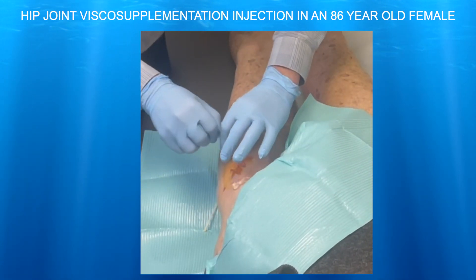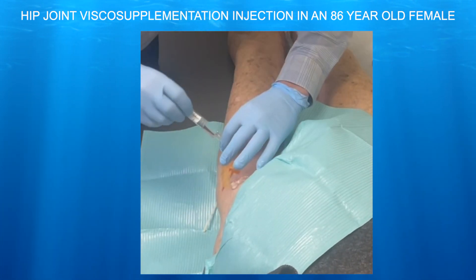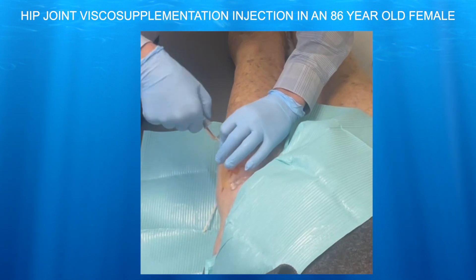We're taking out the stylet now and putting on the visco-supplementation. When you use the spinal needle, you want to make sure to go in with the stylet, as that makes it much easier to get through the tissue.